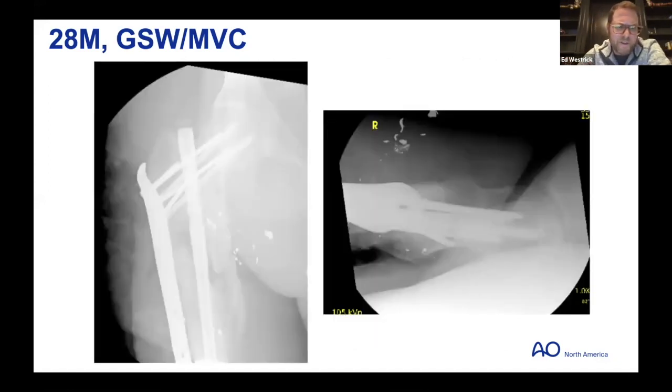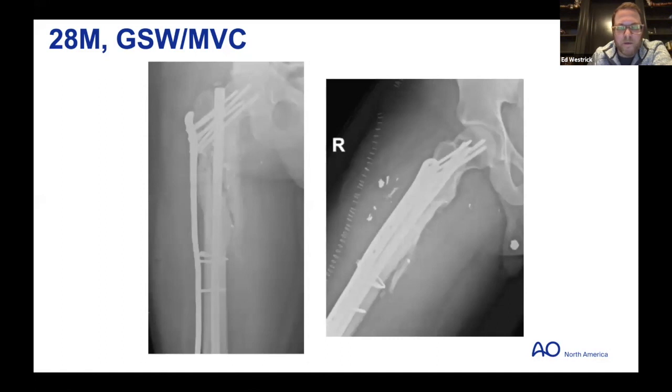And then the next challenge was our fixation. And this is a guy that beat the implant once already. And so we wanted to give him belt and suspenders to withstand whatever he's going to encounter his third trauma trip around. So again, new nail, also a plate, to allow him to go back to doing whatever things he does to get himself in these situations.